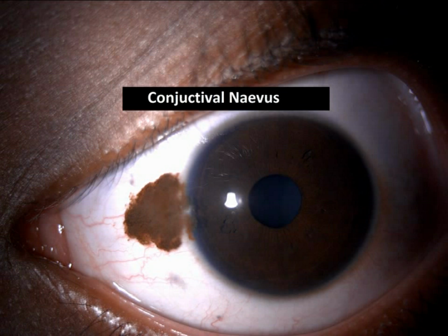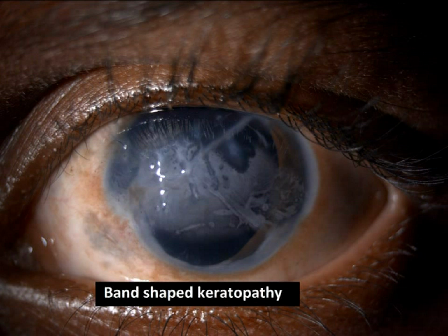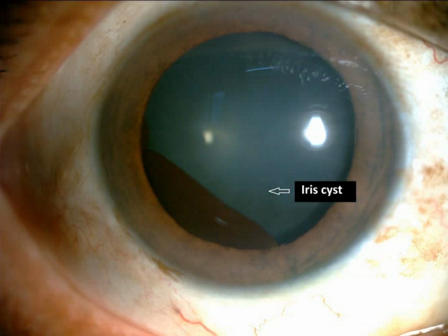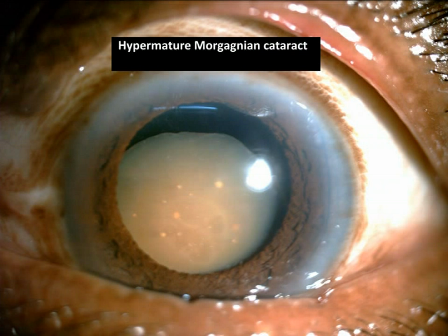conjunctival nevus, band-shaped keratopathy, microspherophakia, iris cyst, and hypermature Morgagnian cataract.